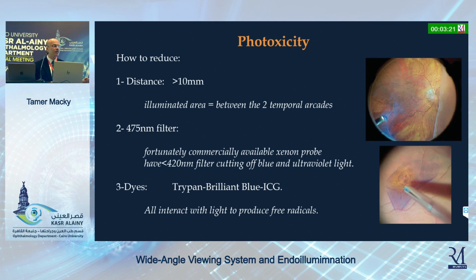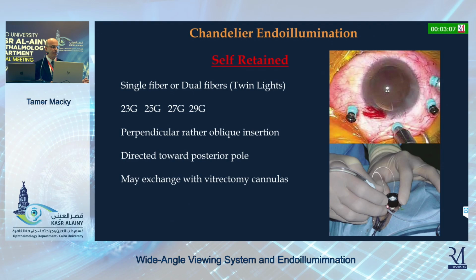The other thing, you have to have a blue filter to cut off the harmful blue and ultraviolet rays, and be very, very cautious during dye use, because the illumination interacts with the dye and produces free radicals.